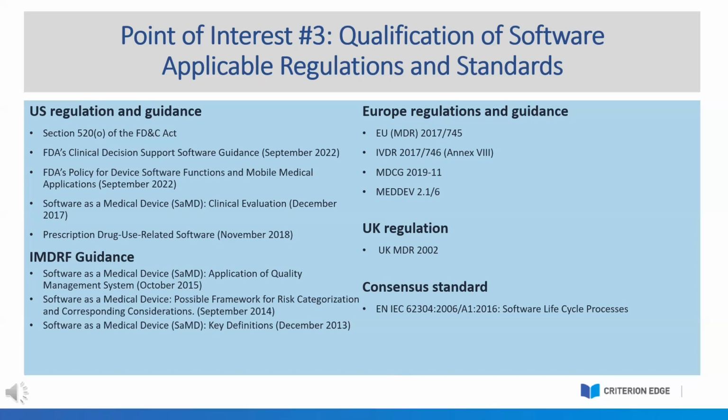One nice thing is that the IMDRF is a global organization, and they have put together a software as a medical device working group that has issued guidance over the last several years and is trying to keep up with the ever evolving and changing landscape of medical device software and mobile applications and wearable and AI enabled device software. And there is also a consensus standard, the IEC 62304, that is harmonized globally and is applicable in all jurisdictions.